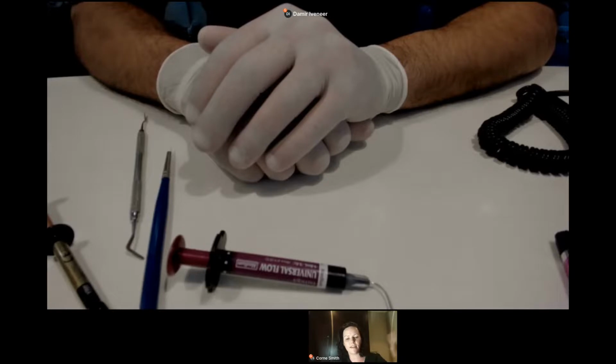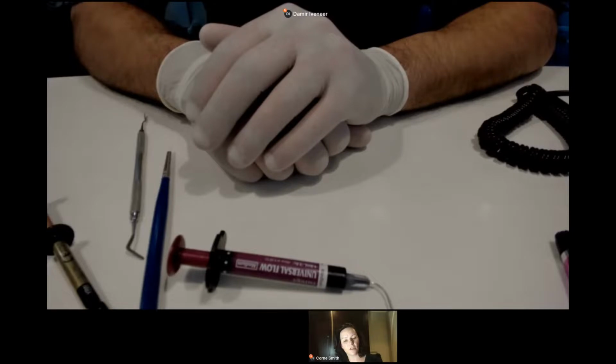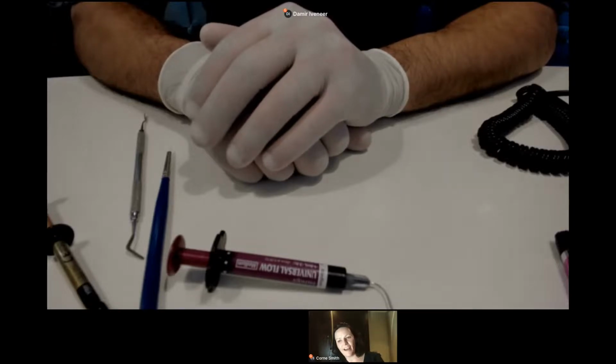And this has got nothing to do with iVeneer or with the composite material. This is an occlusal problem. So start with something simple and then work yourself up to cases where you can add length, but then remember the principles of occlusion. We can never forget the principles of occlusion, and that always stays the same. Exactly. I totally agree. Yes.